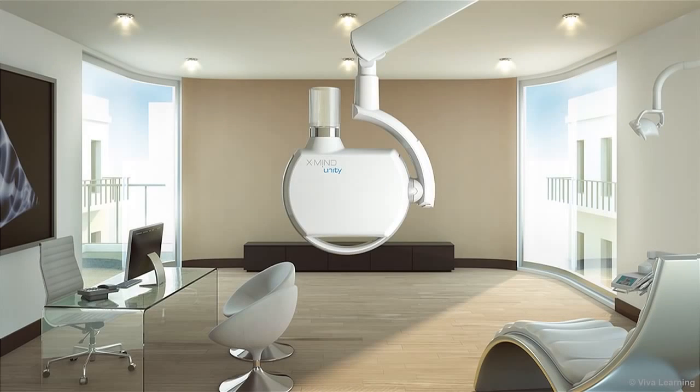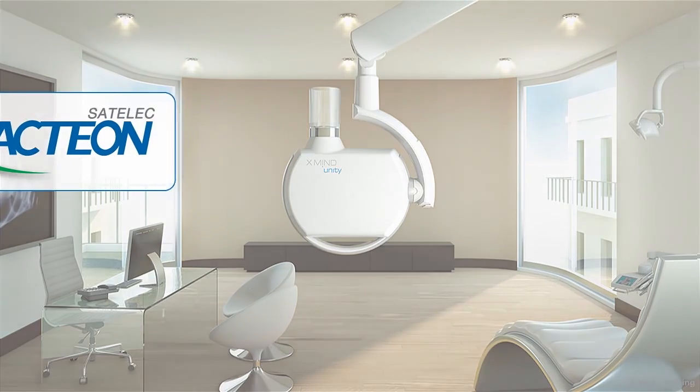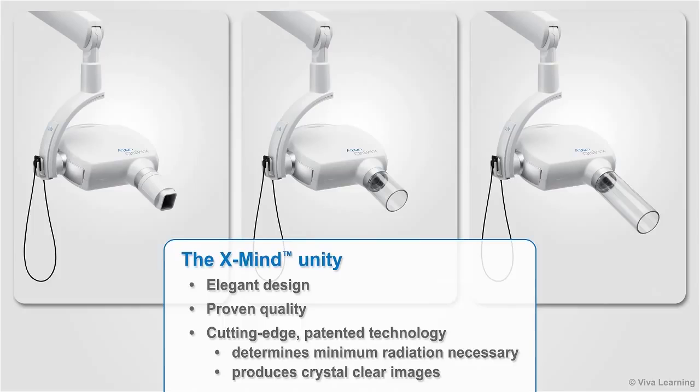The XMIND Unity intraoral X-ray machine is the successor of the XMIND DC, the very popular dental X-ray machine from Satelec, a division of Acteon Group. The XMIND Unity combines elegant design with proven quality and cutting-edge patented technology that determines the minimum radiation necessary in each situation to produce crystal clear images for you.